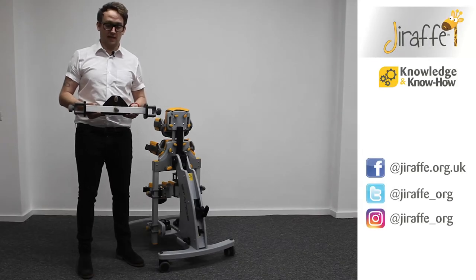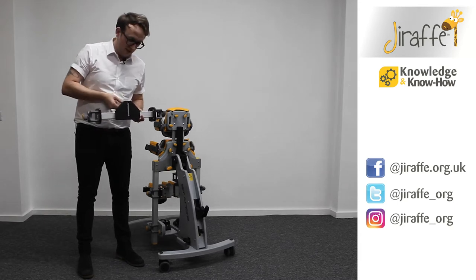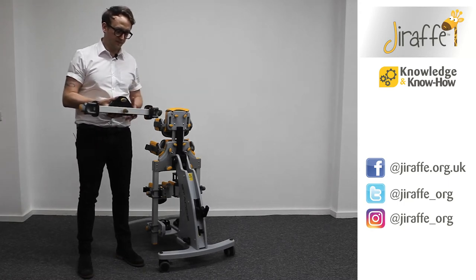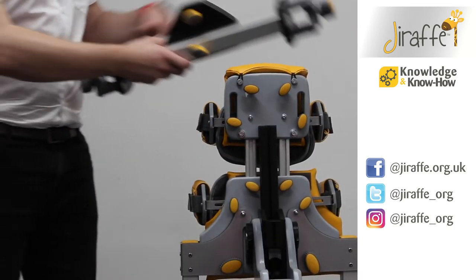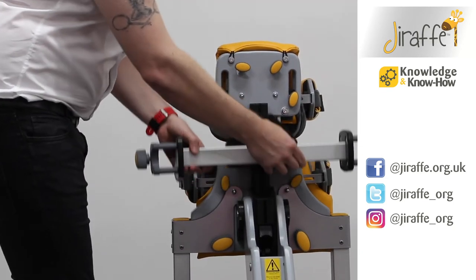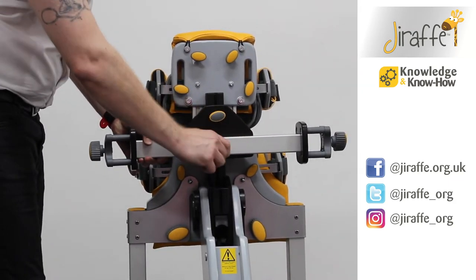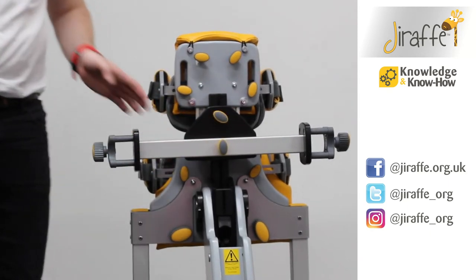To fit the tray bracket to the stands, we've got a barrel nut on the inside of the bracket, which is controlled by the two wing knobs on the other side. The barrel nut is going to go in the middle of the column and we're going to slide it on like so. We can adjust the height of where the tray needs to go, and when we've decided where it needs to go we can just tighten those wing knobs and your bracket is now in place.